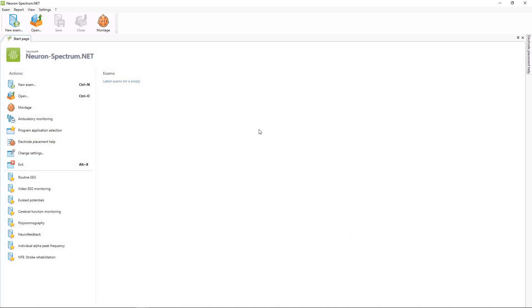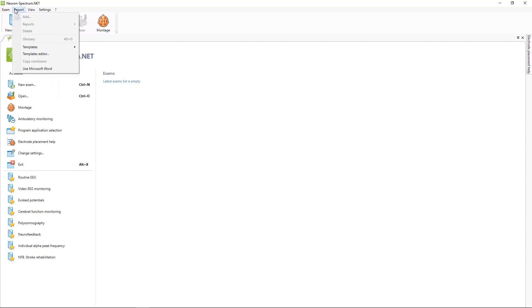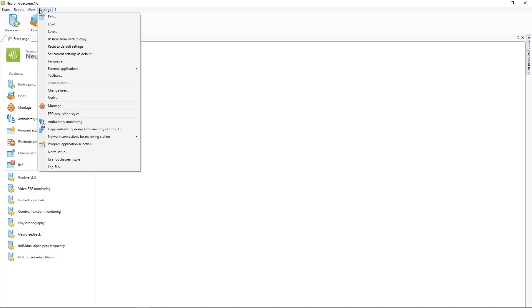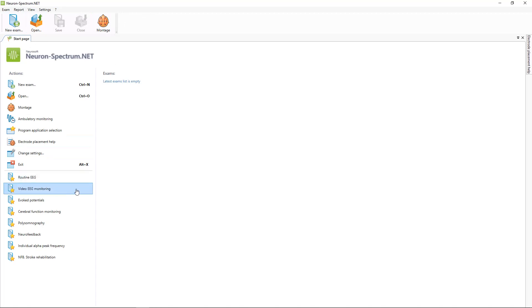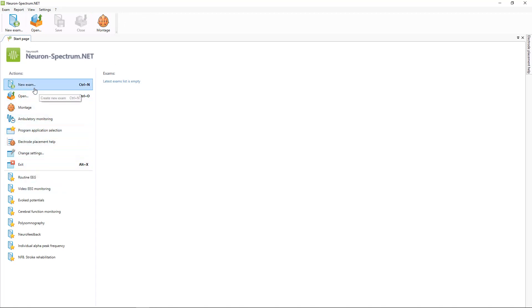Here you can see the main window of the software, here is the main menu, toolbar buttons, and then here is the start page where the main commands are located.